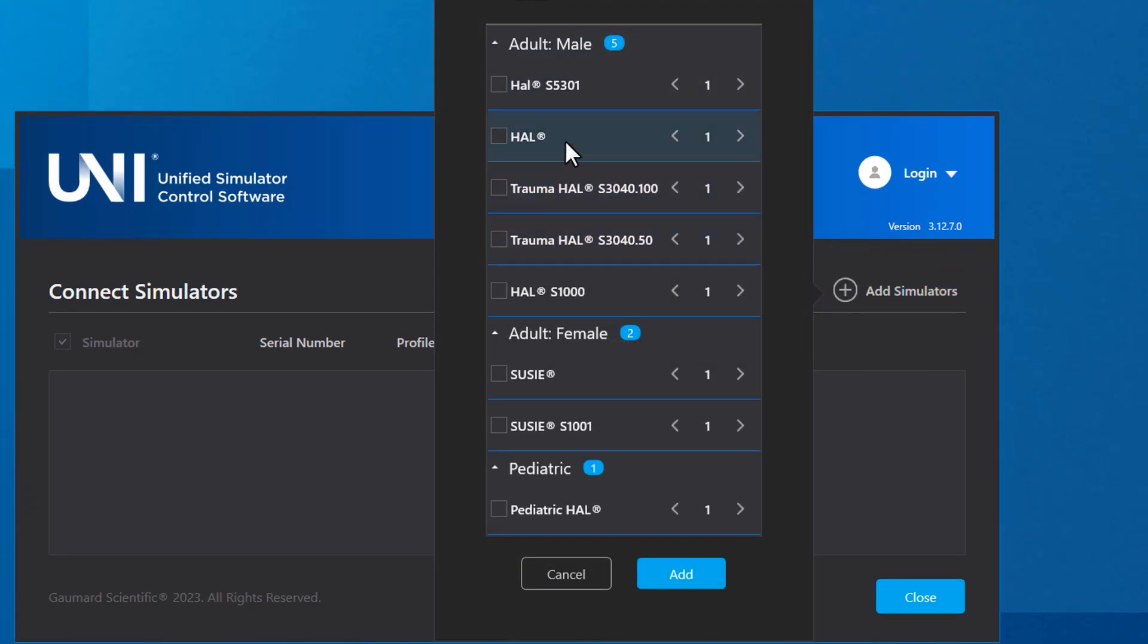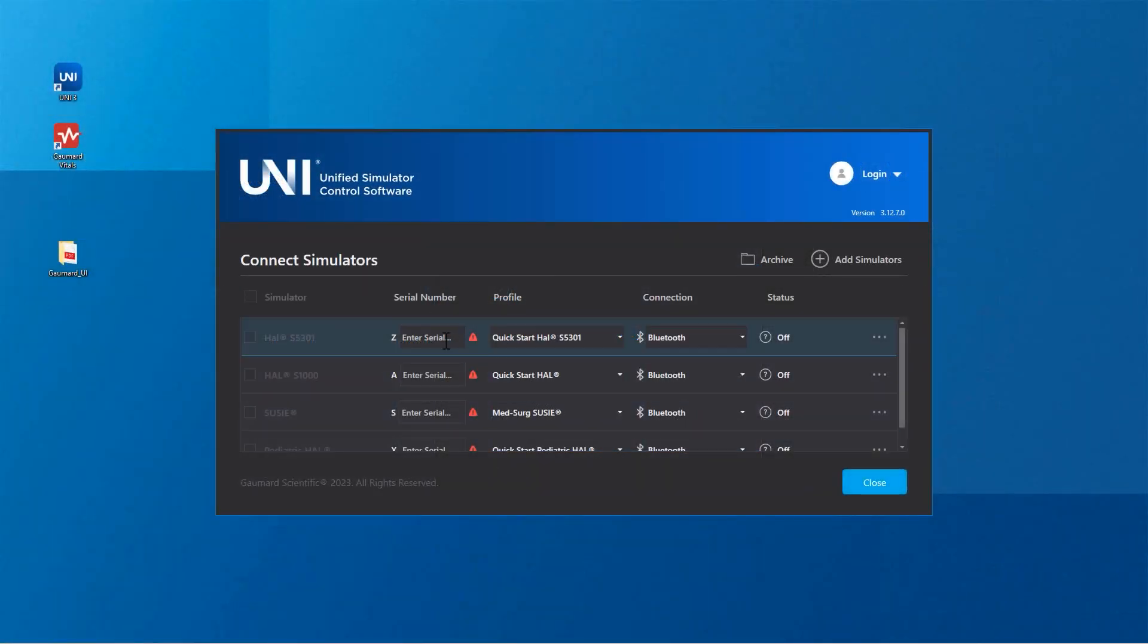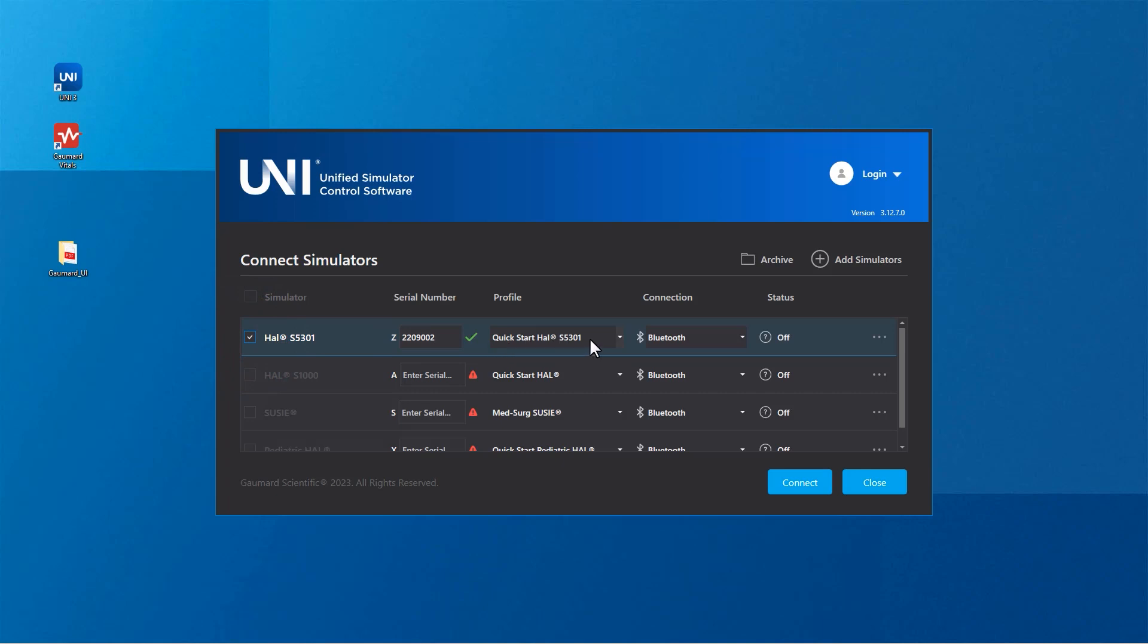Check the boxes next to the simulator types you intend to connect with. Enter the serial number of each simulator you wish to add. Your simulators are now added to Uni3.